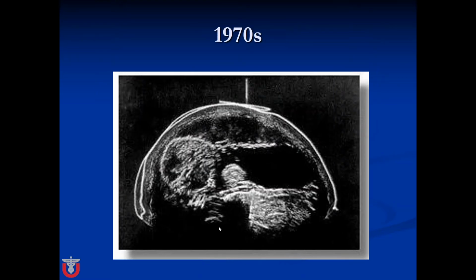By the 1970s, technology has improved. I can tell this is a fetus. I can't tell you anything about it. I can't tell you if it's normal or not normal, but at least I can recognize it as a fetus.